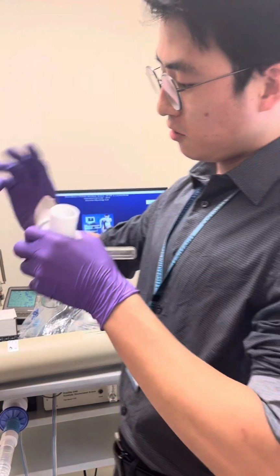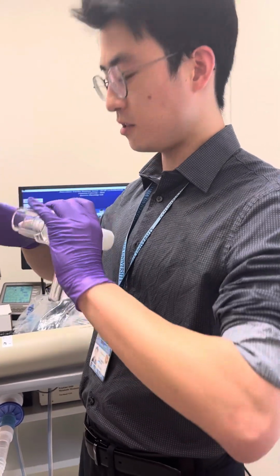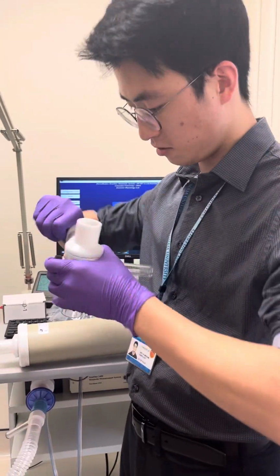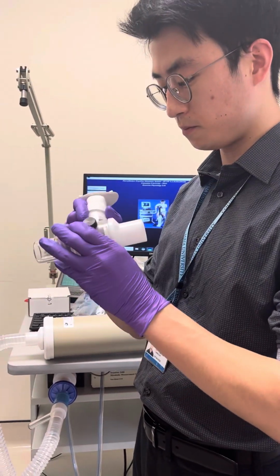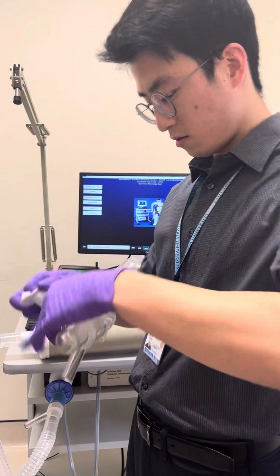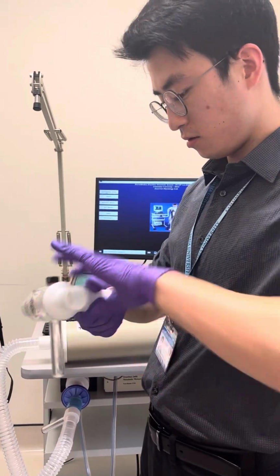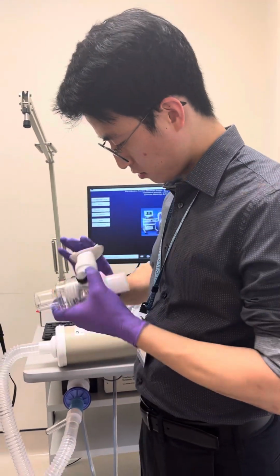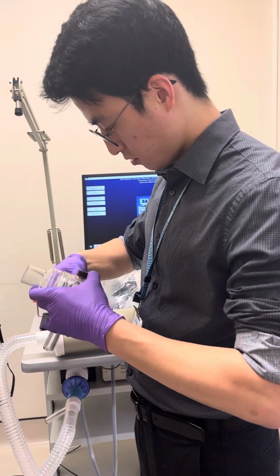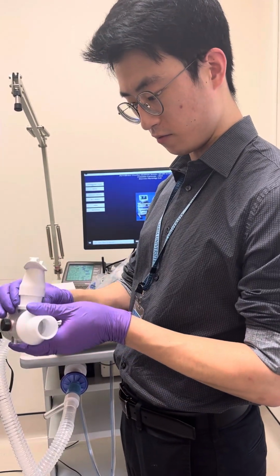Okay, so I just tried this yesterday, and I think it works best if you stick a hand in there and just a thumb in there and mash it in like that. And then make sure that it's straight, and I guess this doesn't rotate very much.